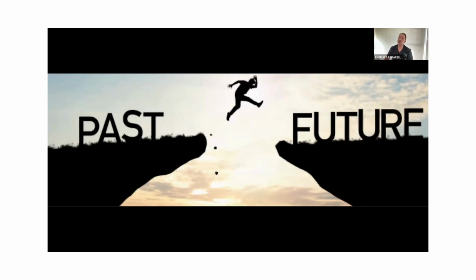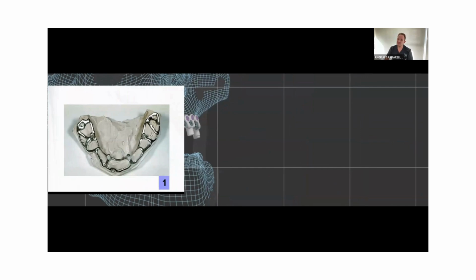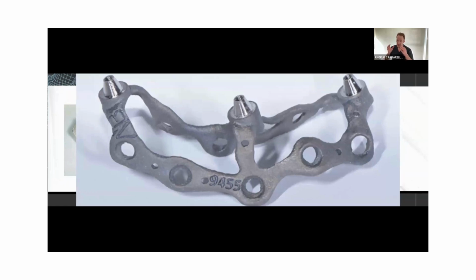Okay, so old concept with something new. And let's see those kind of old customized implant. You can see the different shape. Also, the surface is completely different. Poor quality in terms of the surface. And this is the future. This is how we can use now this new concept about customized implant.